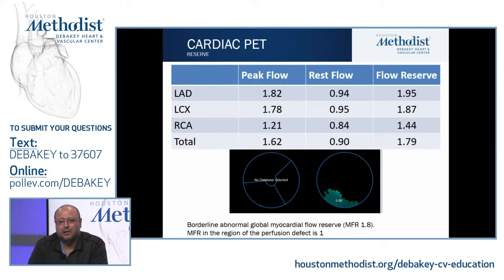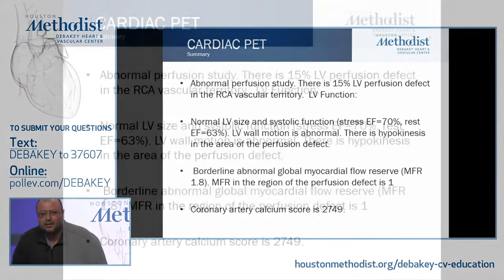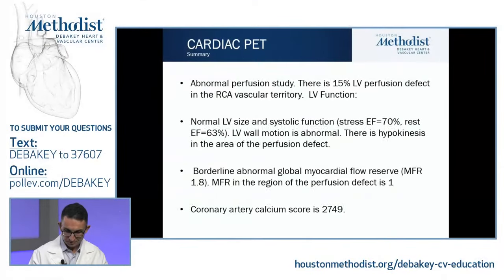And if I remember correctly, this patient had a very high calcium score, above 3,000 or so. Let me show you. His calcium score was 2749. Yeah, so close to 3,000 in this setting.